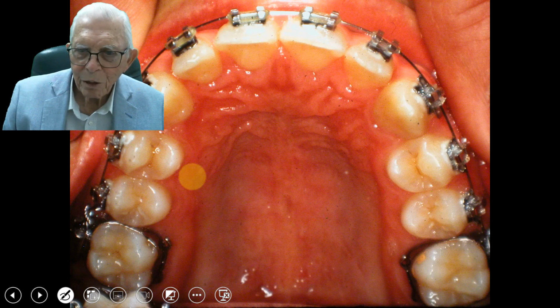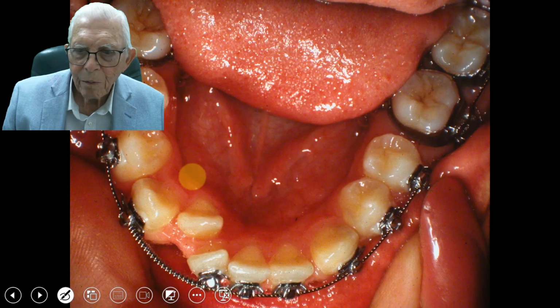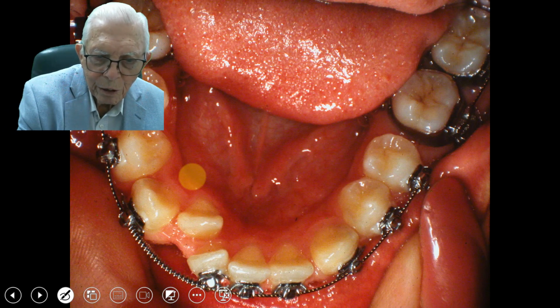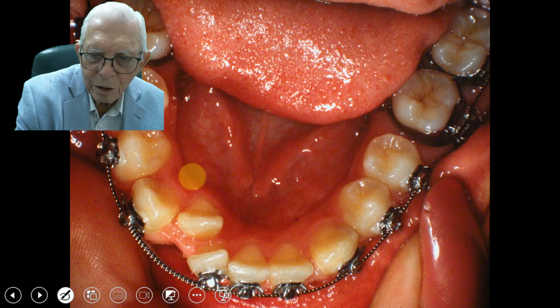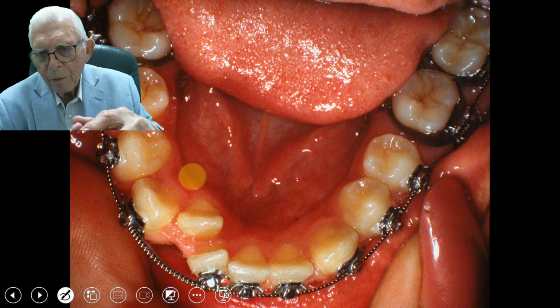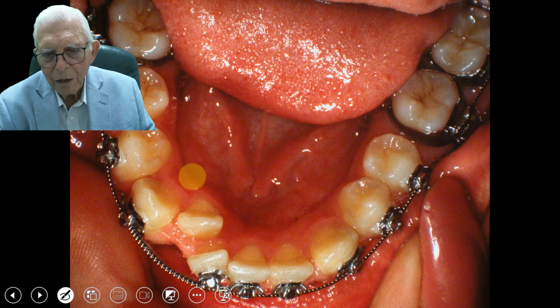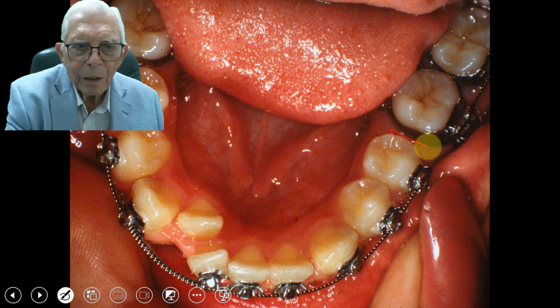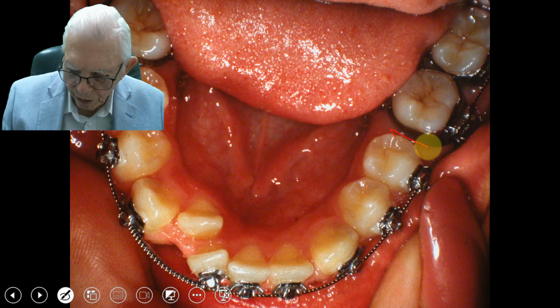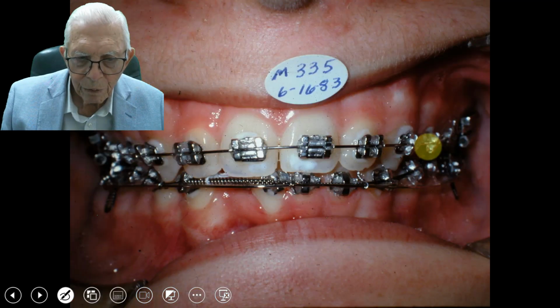Now we've got the upper lined up real good, and now we've got to continue working on this. And we're going to enlarge this a little more. We have to get it down and have room to move the teeth out like that. And we got a little space back here. And then we'll close that in and we can watch that tooth go back into position.